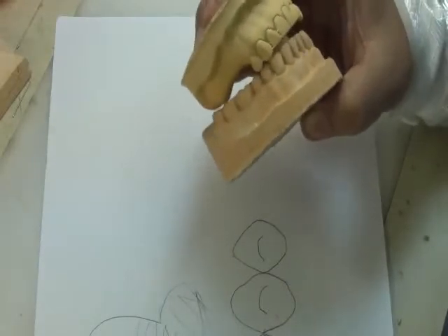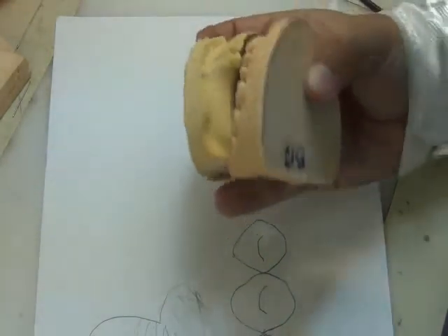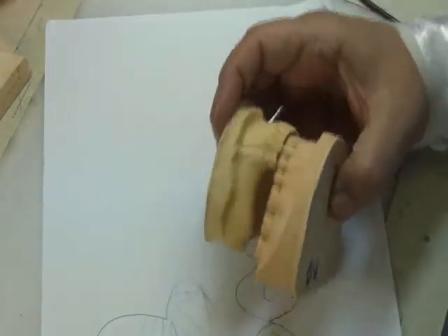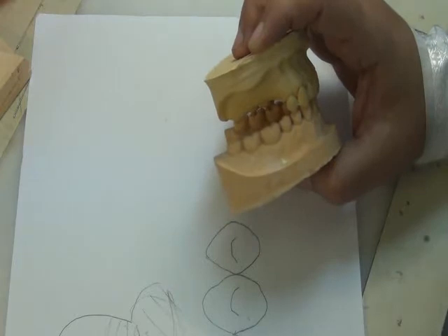Even when I'm trying to set it on the cast, these are not stable, they are mobile. Okay, this mobility causes this occlusion not to be stable. So I need to place it inside the patient's mouth. I will call him for a visit, we call a try-in visit. Okay, sorry, jaw registration first.